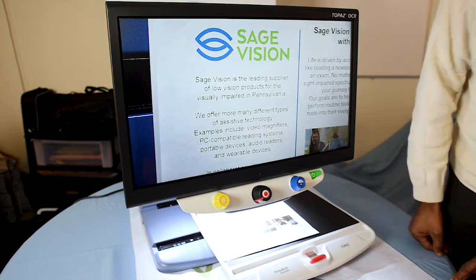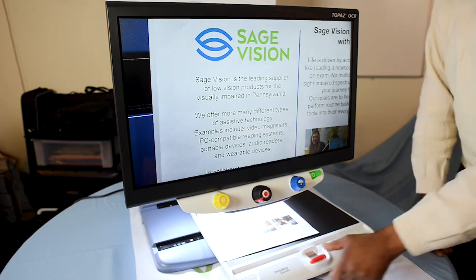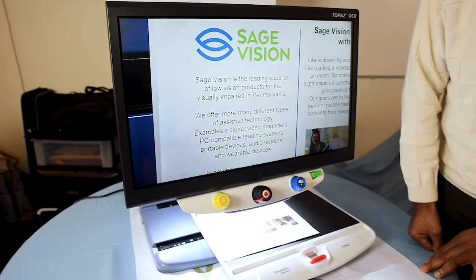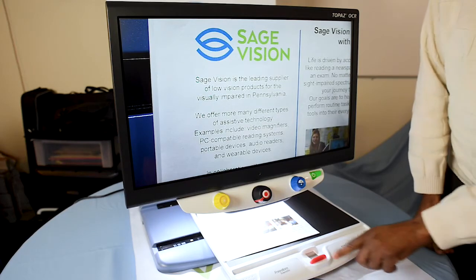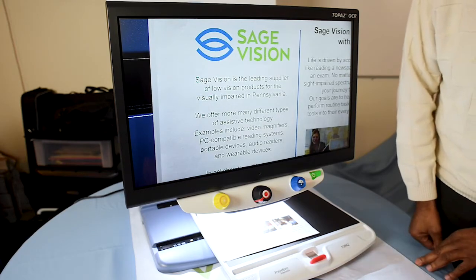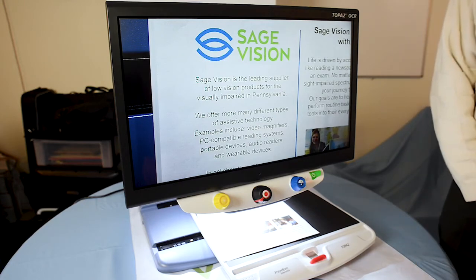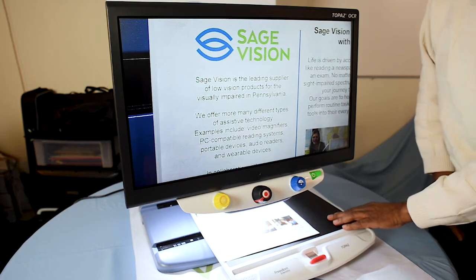There is a feature to lock the XY table into place. We recommend that you lock the XY table by using the red bar and pulling it towards you, if you're writing out checks or doing a crossword puzzle, just so that the table remains steady as you're working.